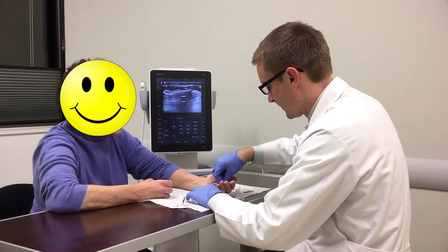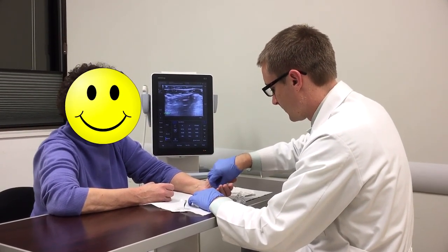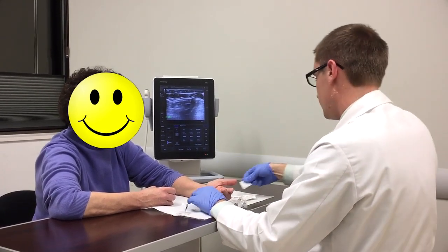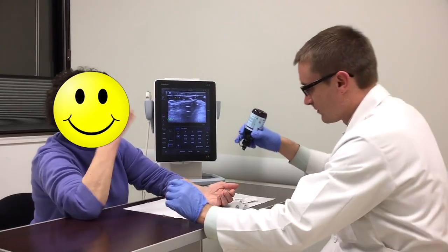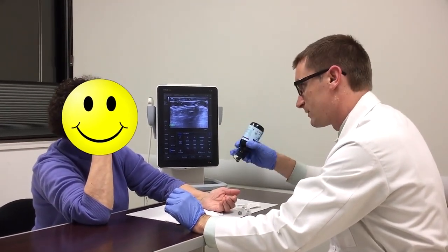The injection site is prepared by cleansing the patient's skin with an alcohol swab. In this video, the injection site is the left index finger A1 pulley. The A1 pulley is immediately superficial to the head of the metacarpal bone.